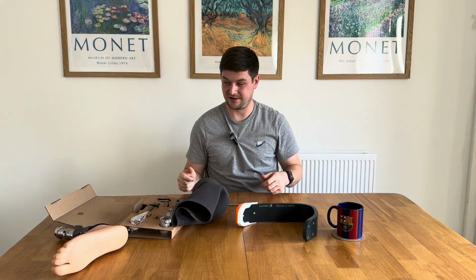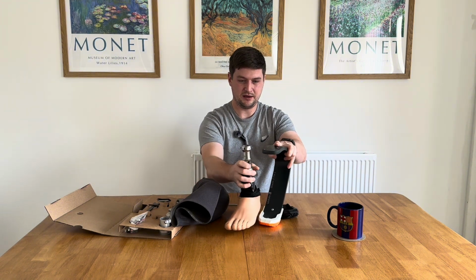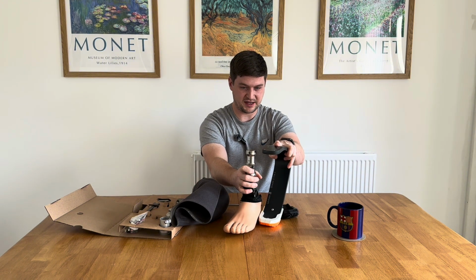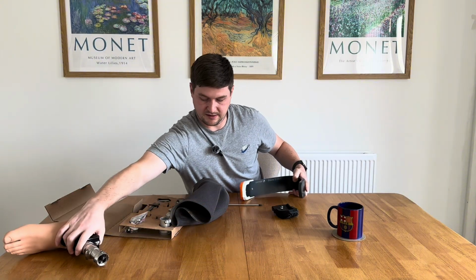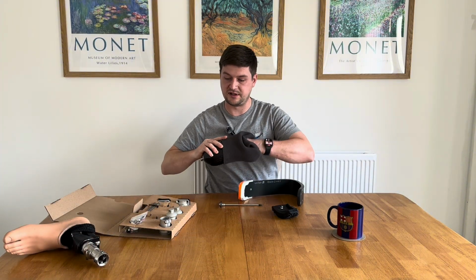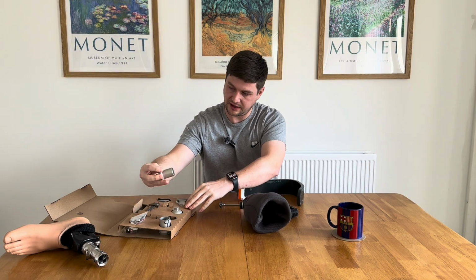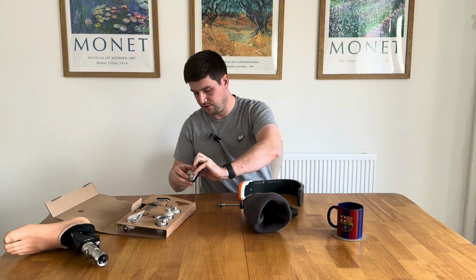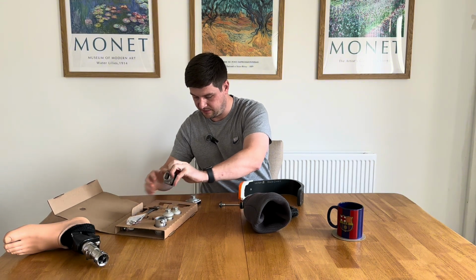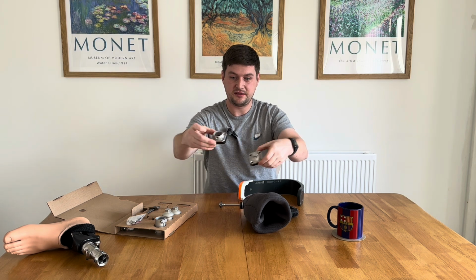But we'll get straight onto this. So now we need a measurement of how high that needs to be. And personally, I don't think we have to put any spacers in at all. Just the main bracket, I think. So put that to the side. Tuck that in there so it's easier to manage. And yeah, we don't have to use any of these poles or anything because we're literally going to use the smallest bracket they provide, which, oh yeah, they provide two different types. That's the type I need.